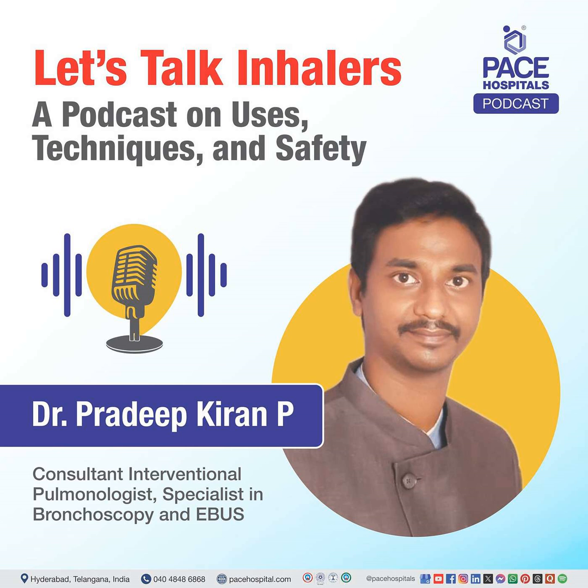So once you have done like this, the next step is you have to put your mouthpiece on the upper side. Now, once you have kept it, this trigger, you can see that is more like a gun trigger. So you will push like this. So it indicates that your dose is loaded. This is the loading. Next, you can see the mouthpiece here. The same as with the dry powder inhaler, you have to keep your mouthpiece inside your mouth as far as possible, and then take a deep breath.